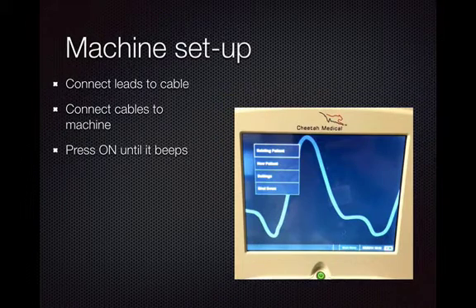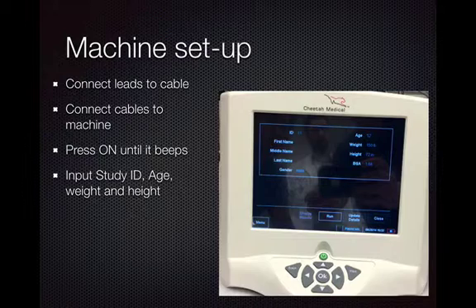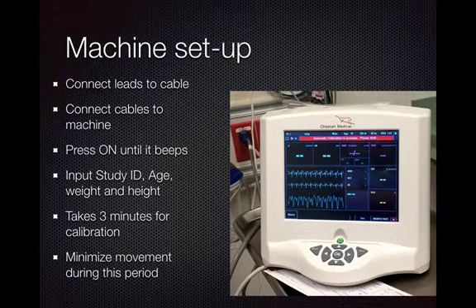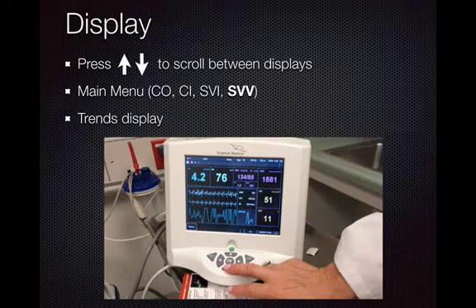You'll get this main menu right here. You'll want to hit new patient, and once you hit that, you'll have to input some data, including the study ID, age, as well as weight and height of the patient. And then it'll go into calibration mode. It'll say automatic calibration in process, please wait. And during this 3-minute interval, you really want to have the patient move as little as possible.